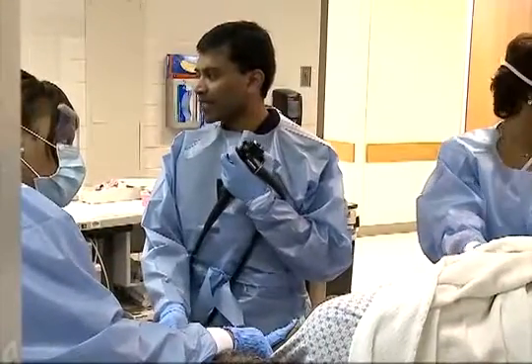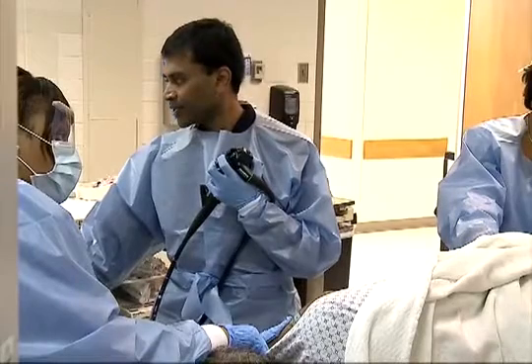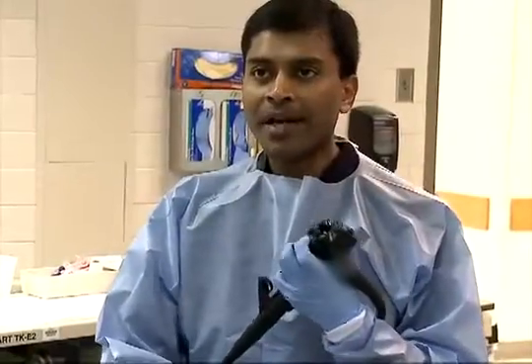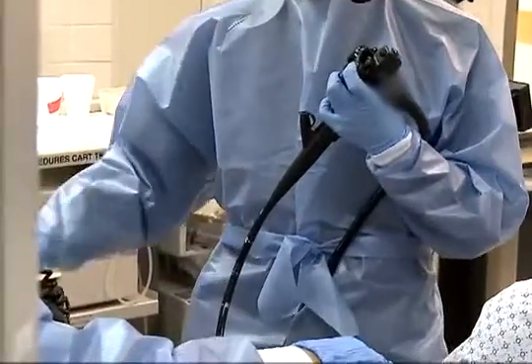Once the aorta is identified, the first branch of the aorta is the celiac artery that you can see here. So this is the aorta, and the first branch is the celiac artery. And here I am identifying the celiac, and I am advancing the scope forward and letting go of my up-down dial on my scope. To track the pancreas to the tail, what you do is torque the scope clockwise and withdraw the scope gradually, and you trace the pancreatic duct to the tail region of the pancreas.